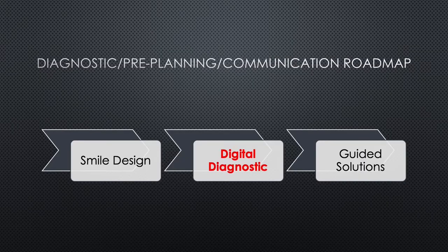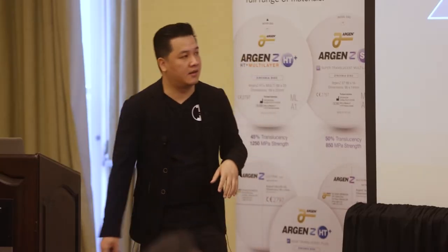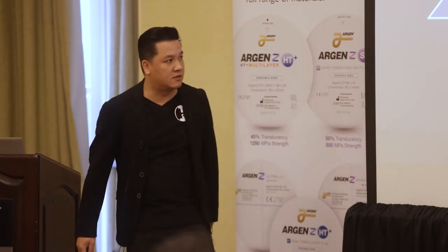So then, of course, sometimes if the doctor thinks that the patient's really good, they'll pair the diagnostic with the smile design. But if they're just dipping their feet and just trying to see if they want anything, we might do the smile design separate from the diagnostic after the first consult.